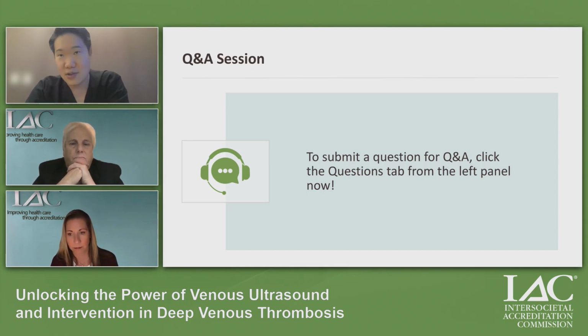But by and large, the interesting thing these days is that the technology we have, and again, I listed half a dozen different pieces of technology, a lot of them are generated and designed specifically so that we might be able to use them in the veins, inside the vascular structures. And so the engineers who've designed these have specifically said, how do we make sure that they are safe to put in there and that they are not going to cause damage to the vessels under routine use, which is going to be the vast majority of cases.